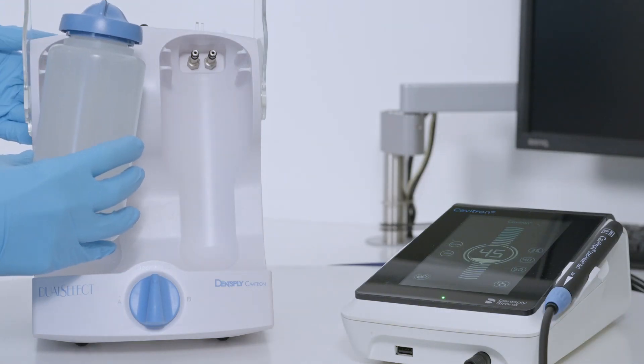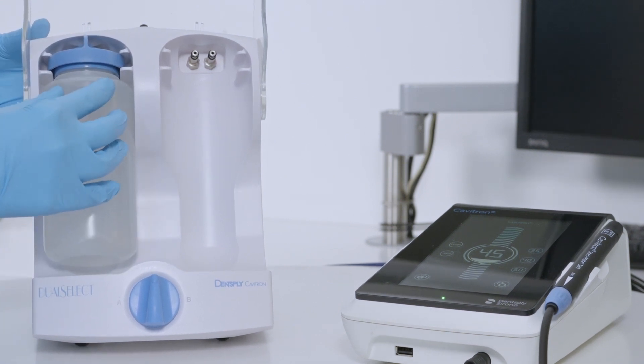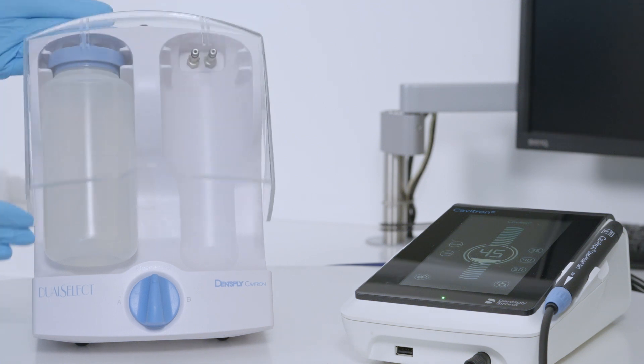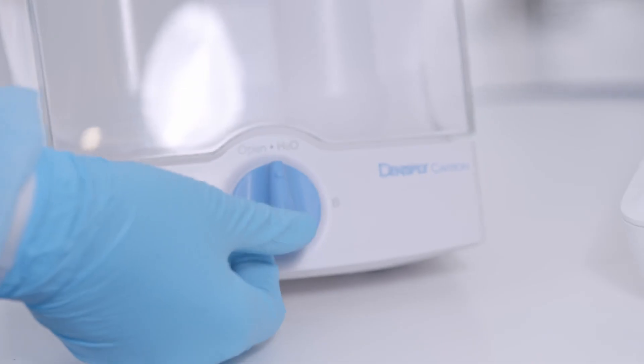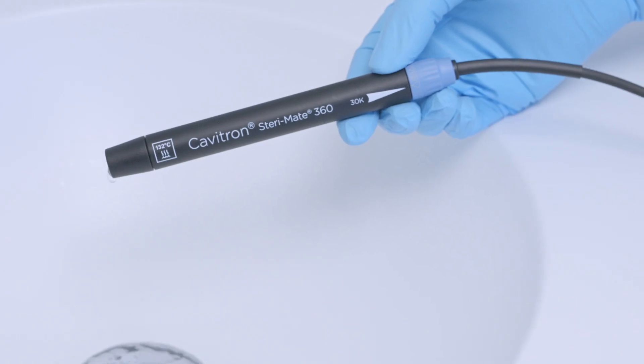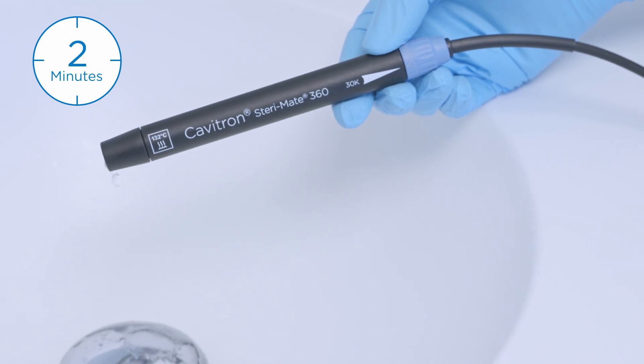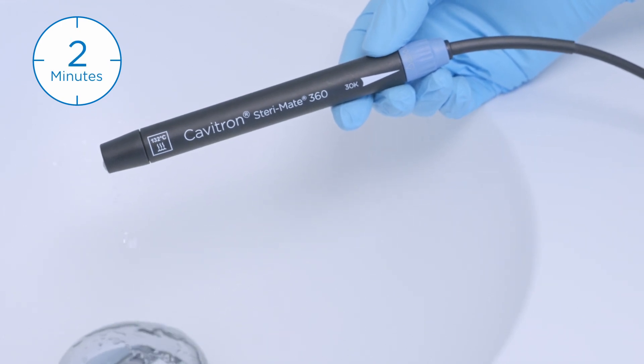After the minimum 10 minute wait time has passed, fill another bottle with clean water and place it in position A and close the shield. Set the selector knob to position A and operate the Cavitron system at maximum water flow for at least two minutes or until all the sodium hypochlorite odor disappears.